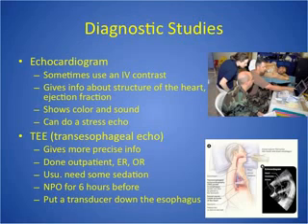Continuing on, echocardiogram. That's the picture you see up here in the upper right. You have to look pretty closely, but you see he's got a little ultrasound device, and he's just putting it on the man's chest. He's wide awake, it's not painful, and he's watching on the screen. So generally, an echocardiogram is not painful. It just uses ultrasound waves, so they'll have a little bit of jelly on the chest. Sometimes they'll turn the lights off and the room will be dark. Occasionally, they use an IV contrast, so we want to make sure we know whether they're doing that or not with an echocardiogram, but it is not the norm that everybody has that IV contrast.